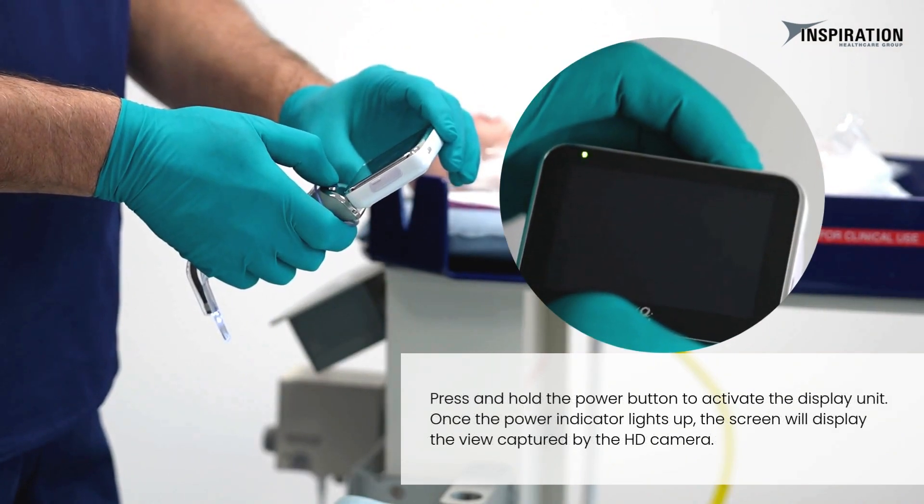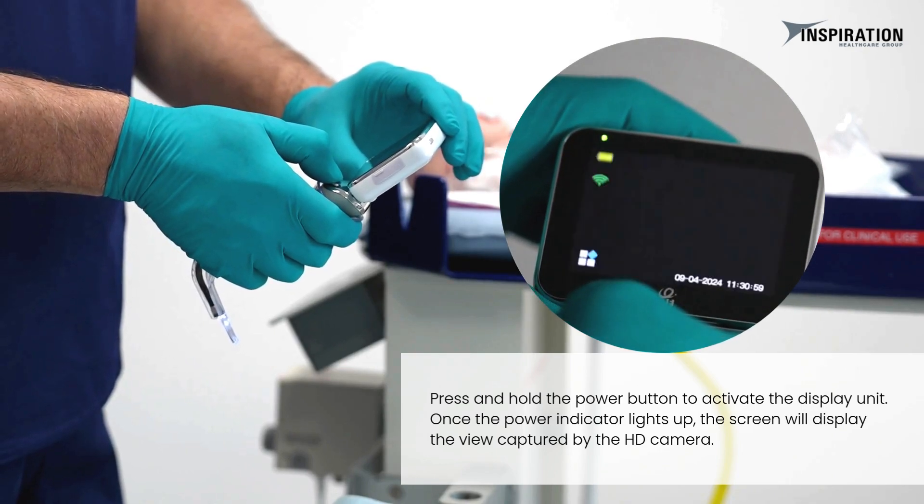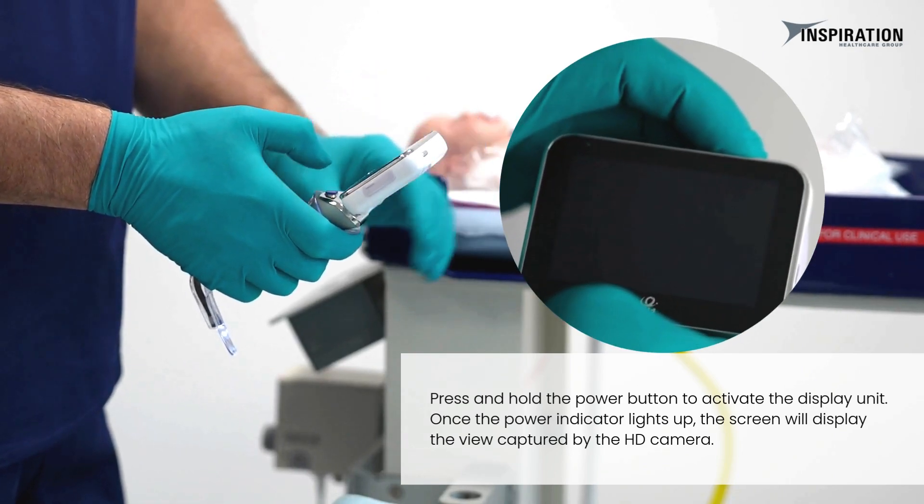Press and hold the power button to activate the display unit. Once the power indicator lights up, the screen will display the view captured by the HD camera.